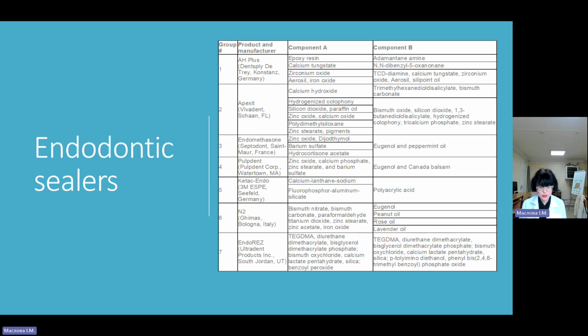However, with a reduced internal canal width, the reduced volumetric flow and increased pressure may be caused. In addition, increasing the rate of insertion does not necessarily improve sealer flow. This depends on the sealer used and the width of the root canal.